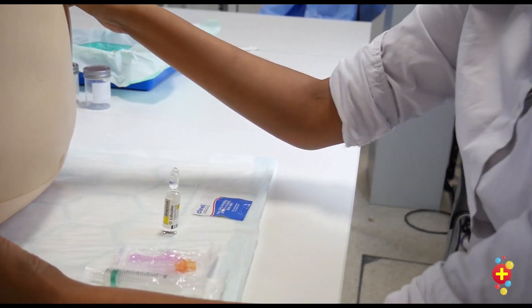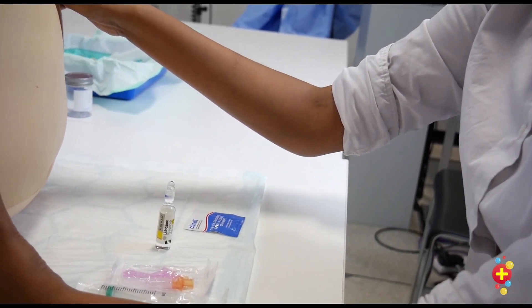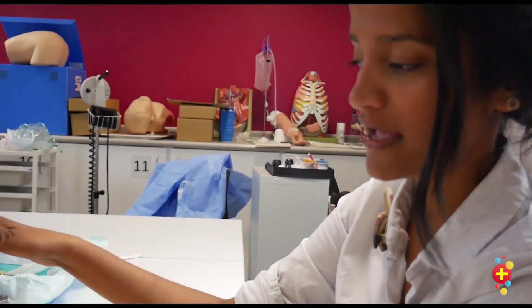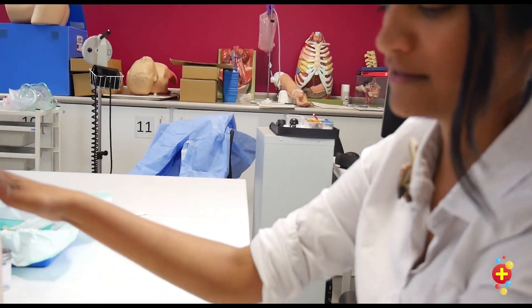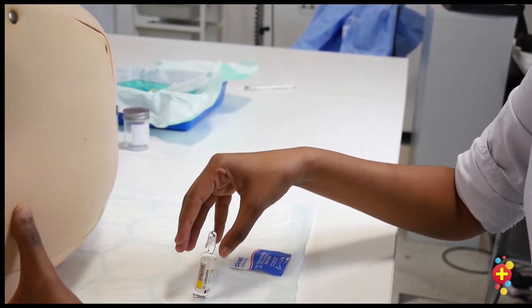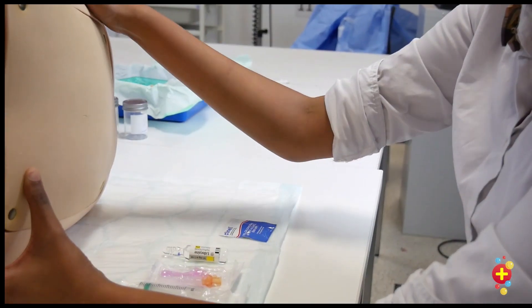As anesthetic, you can use topical anesthetic such as LMX to be applied prior to the procedure, and/or you can use local anesthetic such as Lidocaine. In the neonatal age group, we would usually use sucrose as an adjunct to the procedure.